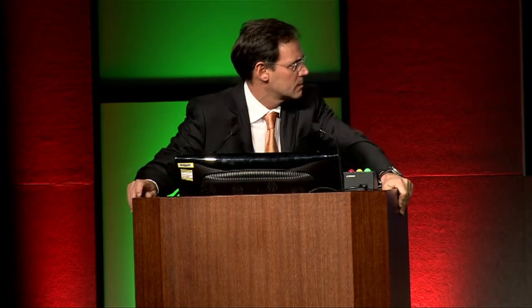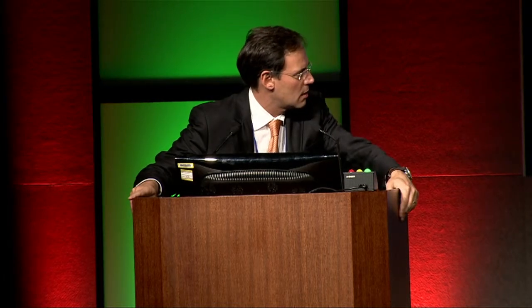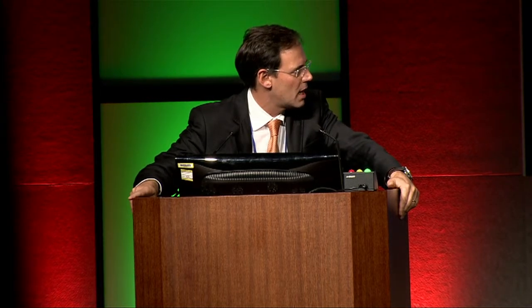Carlos, really outstanding and beautifully illustrated. You used a 3.5 balloon, but at, I can't remember the atmospheres, 16 atmospheres? 14 atmospheres. It went up to 4.2. And then you just alluded to saying you'd use a 4.4 balloon. What do you mean by that? Do you mean you'd go up even higher, or is there a 3.75 balloon that goes to 4.4? No, I mean the 4 millimeter Pedra balloon from Biotronik, it goes through an 18 gauge needle. We used a 17 gauge needle. So we try to put in larger things. Now we are more confident, so we are over-dilating the valve a little bit, by maybe 20%.